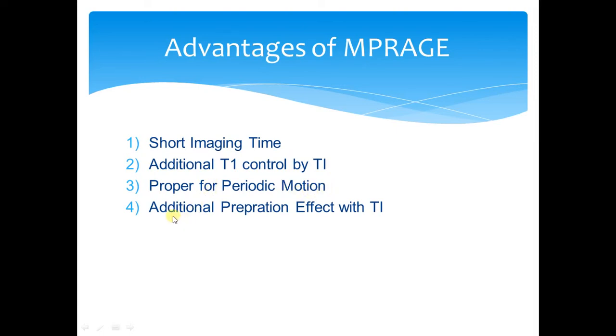And the last advantage of MPRAGE is that we can use this sequence for additional magnetization preparation, such as spatial or chemical saturation, by changing the magnetization recovery time.